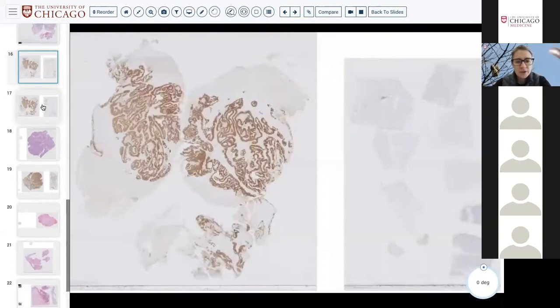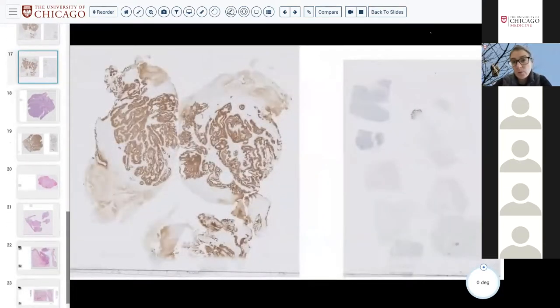You can confirm with characteristic immunostains that would otherwise also stain colon cancer, so you have to exclude that. Whenever we make this diagnosis, we ask: does the patient have colon cancer that could have metastasized to the nose, because that happens, and does the patient have some kind of occupational exposure history, like wood dust or leather dust?